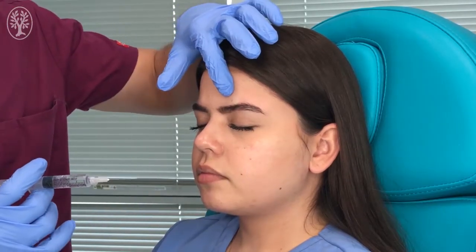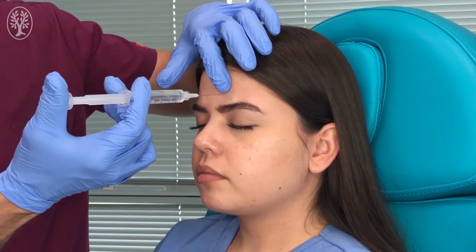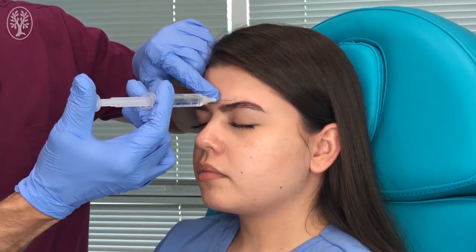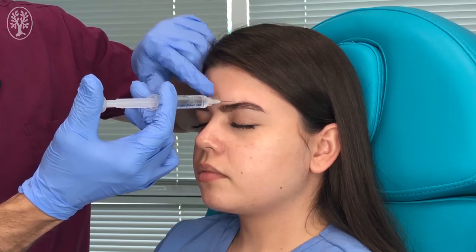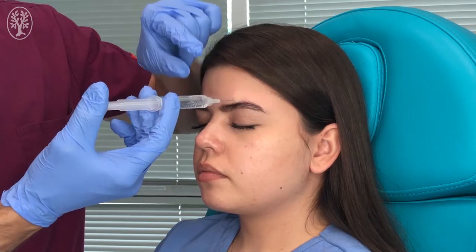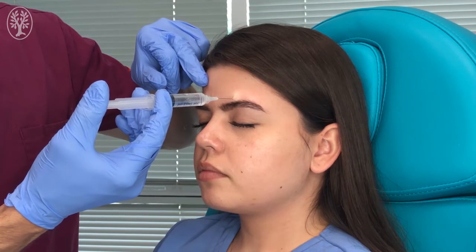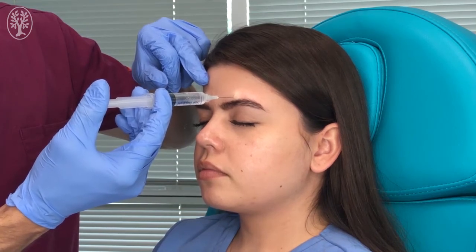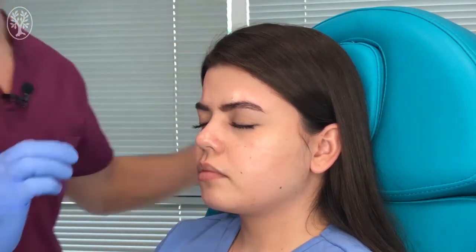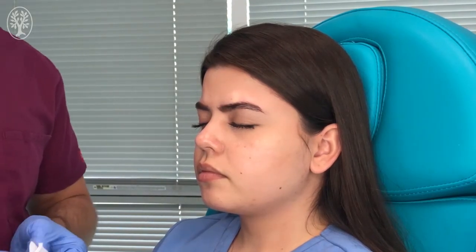Once we have identified the supraorbital nerve block site, we go perpendicular to the skin at a 90 degree angle and inject down to the bone. We aspirate to make sure there is no perforation of a blood vessel, then inject local anesthetic until we create a wheal — about one centimeter. After a minute, that area is going to be numbed. And that was the supraorbital nerve block.